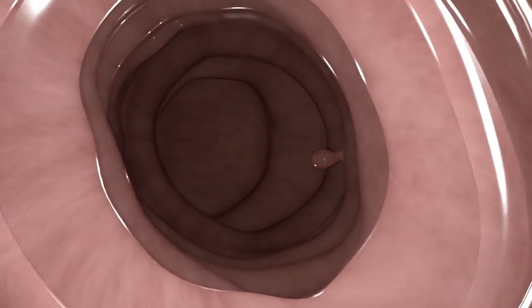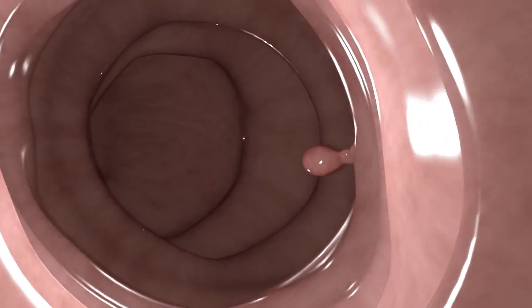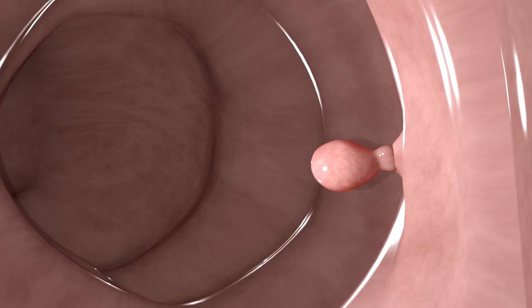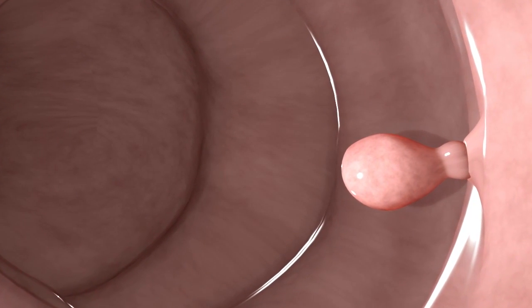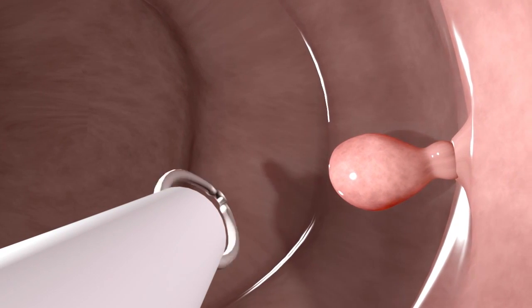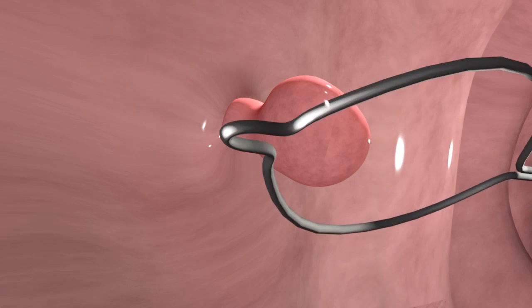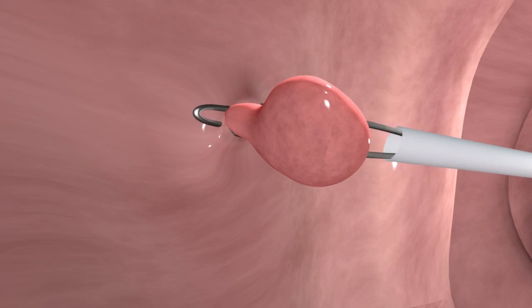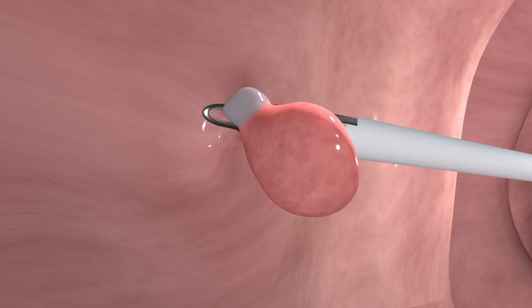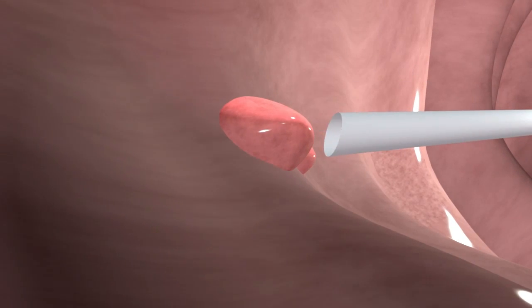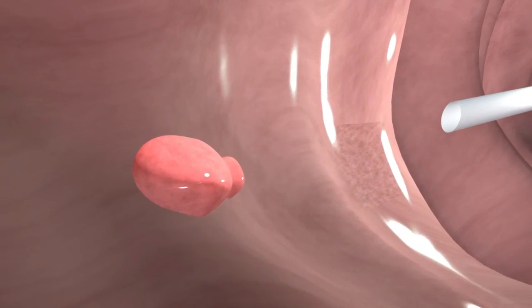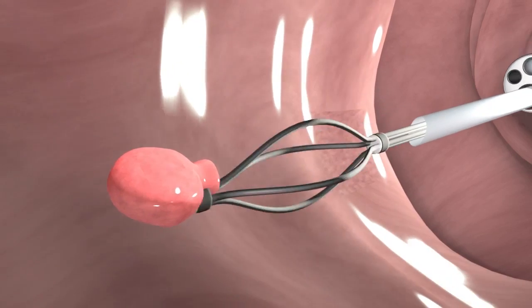Certain types of growths and polyps have a chance of turning into cancer. During a colonoscopy, the gastroenterologist will be able to remove polyps and tissue samples using specialized instruments. Usually, a snare is used to cauterize and cut off the polyp from the colon wall. The polyp is then removed through the biopsy channel. Removal of polyps is painless because there are no nerves in the lining of the colon.